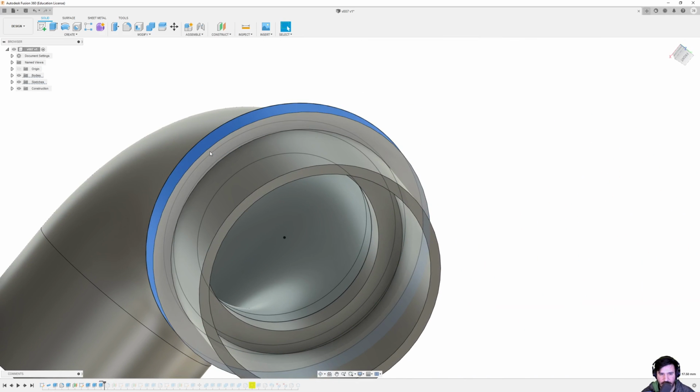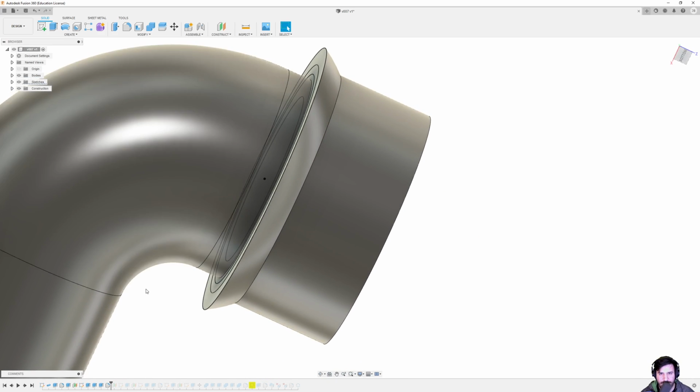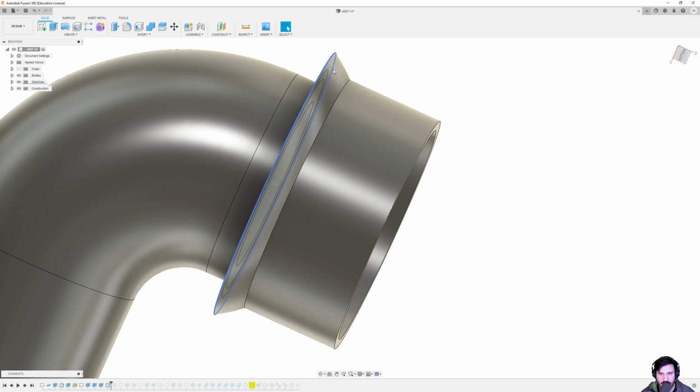And then finally, you can see this right here. I extruded this face forward to serve as that filleted kind of wedge shape. And the next thing I did was actually put that fillet on there. You can see up here. It just helps center it, which is nice as well when you go to plug it in, go to connect them. It helps self-center it so that the clasps on either side are not too far off to the left or right, which they help center it as well, but that just helps you prevent jamming it in and maybe breaking the clip a little bit.